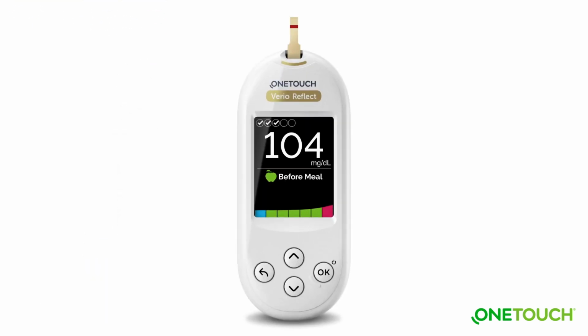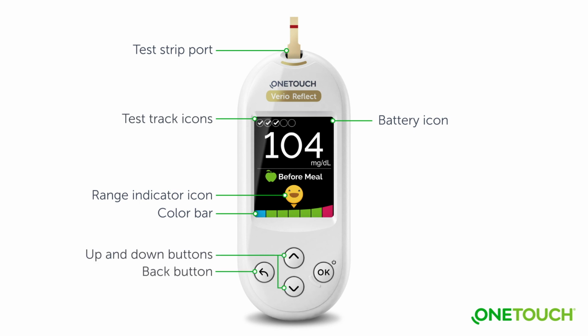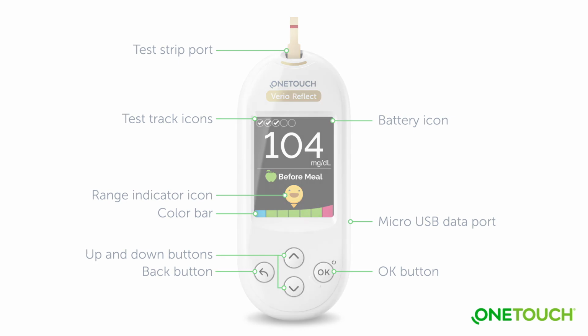Getting to know your system. The meter features a display backlight for better visibility, a battery icon that appears when batteries are low, a color bar and range indicator icon, a push-button panel for screen navigation, and a micro USB data port. The meter is also designed to work with the OneTouch Reveal mobile app.